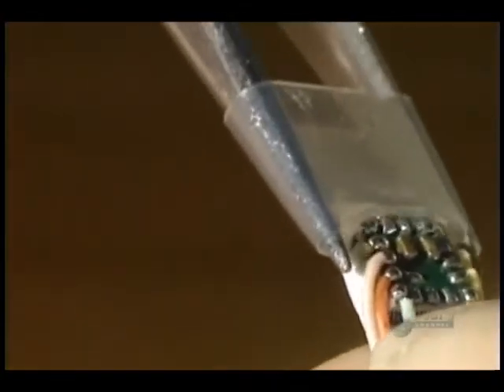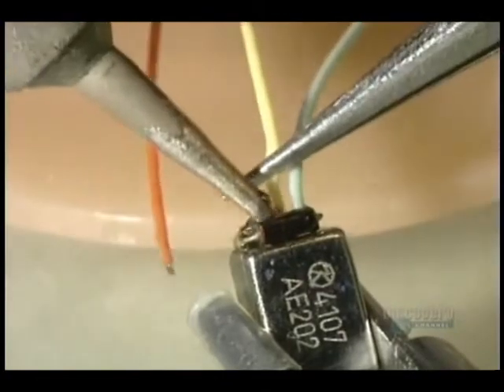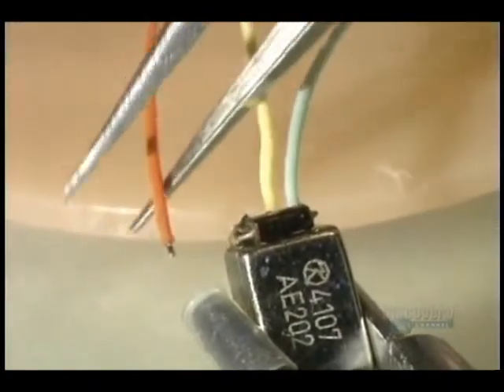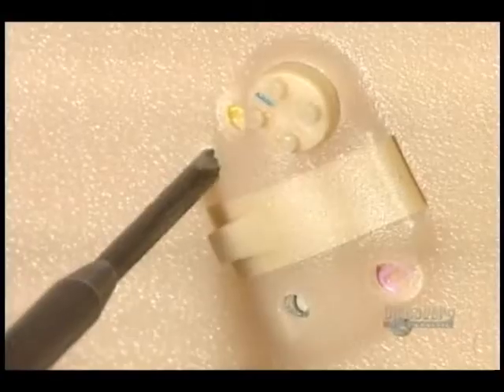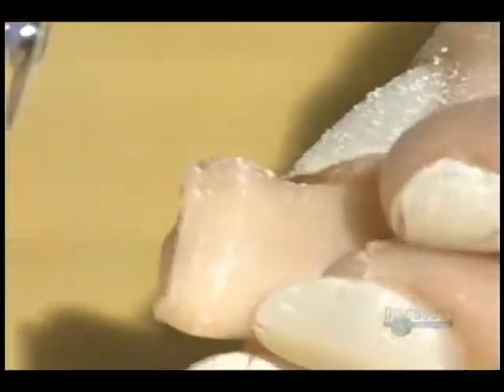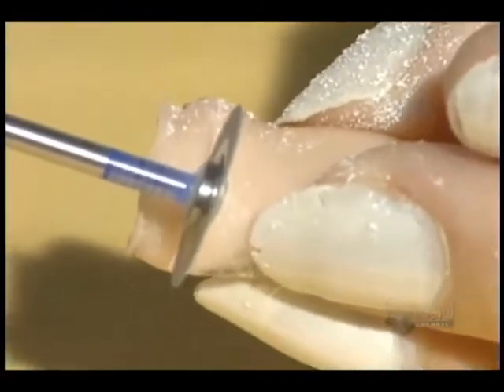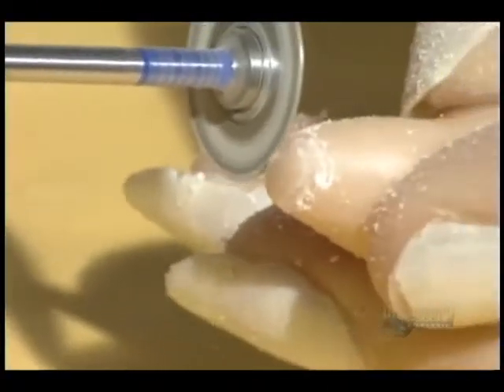The hybrid circuit is inserted into a silicone casing which assures it protection. Then the wires are soldered to the speaker and they verify the proper functioning of the volume control. A hearing aid must be very discreet. That's why they cut the excess with a diamond disc. They also remove the roughness with fine sandpaper.